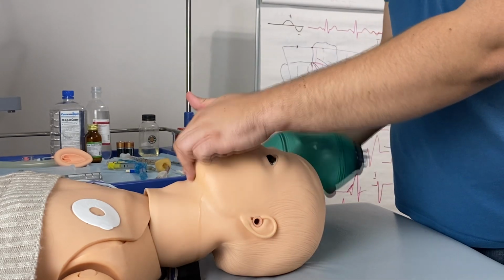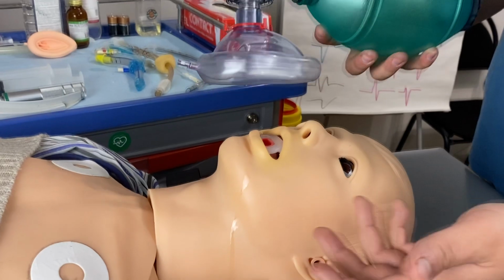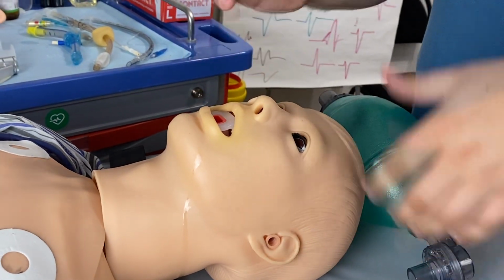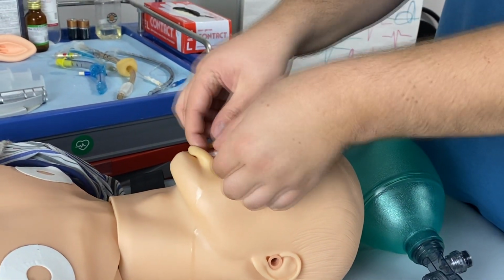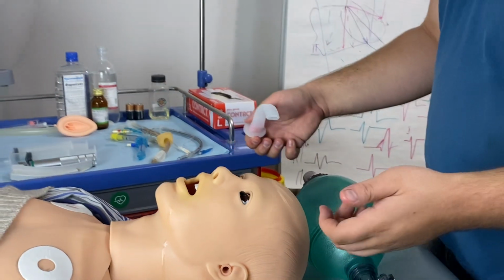Now we don't have to do this maneuver, the open airway, because we have already installed the tube, and now we're not worrying about the tongue slippery. To remove the tube, we just pull it out without any maneuvers.